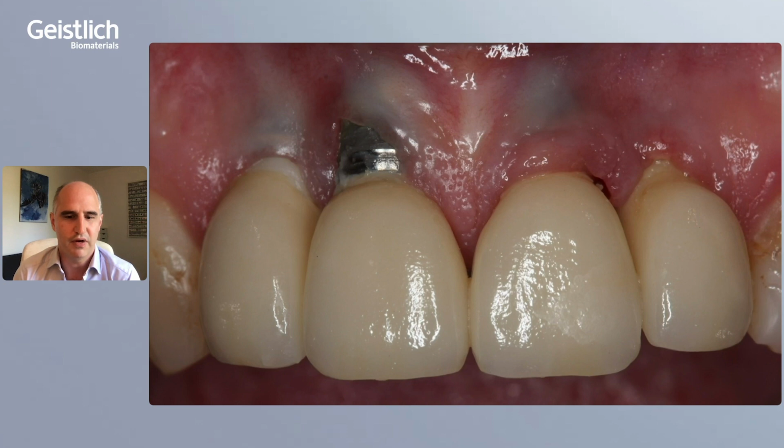Of course, what we're already expecting, there's no bone underneath it, and we probably see that the implants are malpositioned, they're more positioned to the buccal side. So the question is, can we correct this also with the same approach we learned around teeth? So what did we learn around teeth? Well, we learned we do not need to take care about bone. The only thing we need to do, we need to increase soft tissue thickness. We need to cover our recession with attached mucosa, and we need to stabilize the flap in this coronal position.